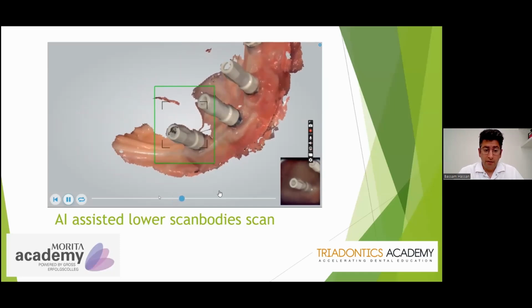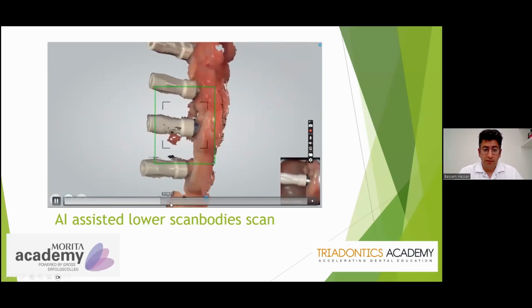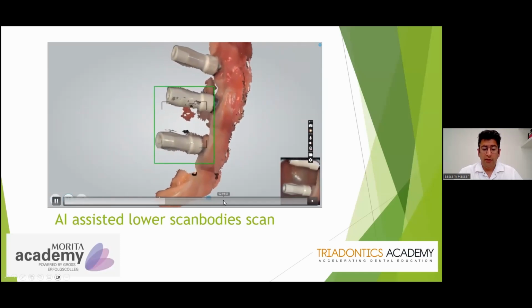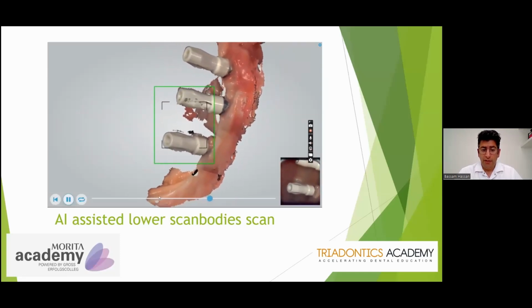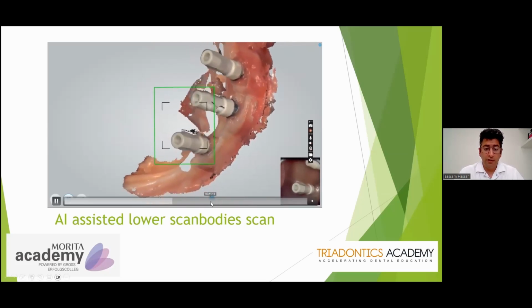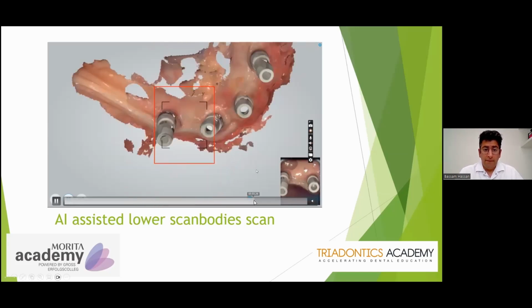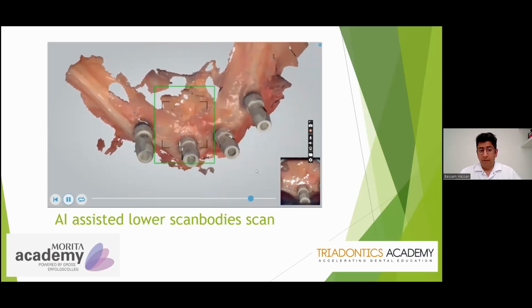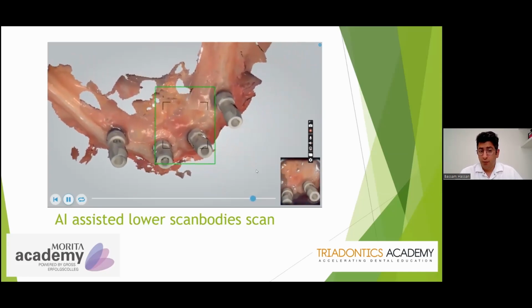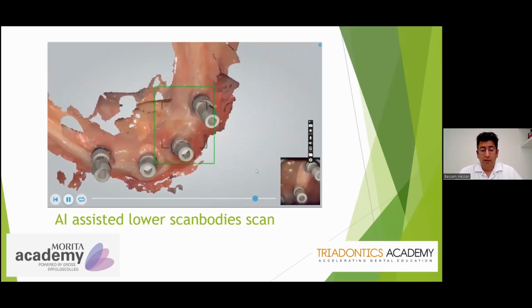I mean, even with a difficult situation like this one, if you are taking this very slowly and you know what you're doing and you're keeping your references and you understand how the stitching process of the intraoral scanner works, you could actually scan this one as well. And again, this was impossible to do just a few years back, we couldn't even imagine doing scans like this, in which there are no references in the jaw.